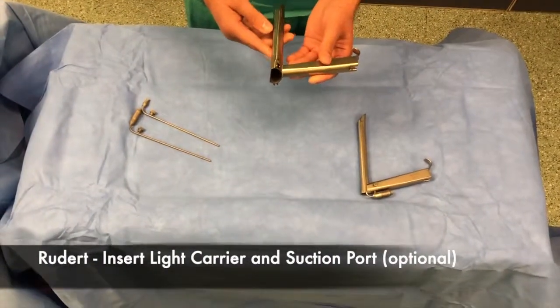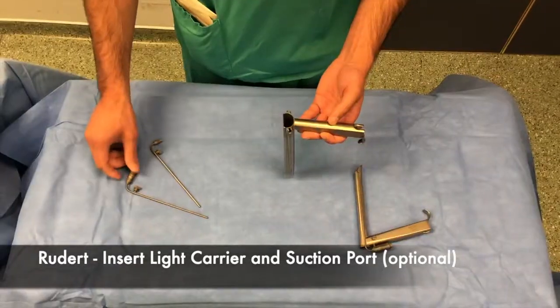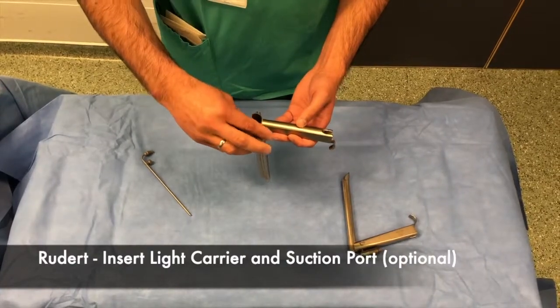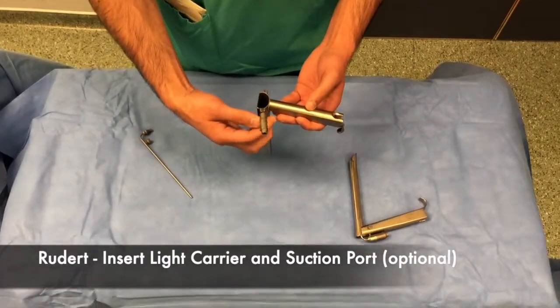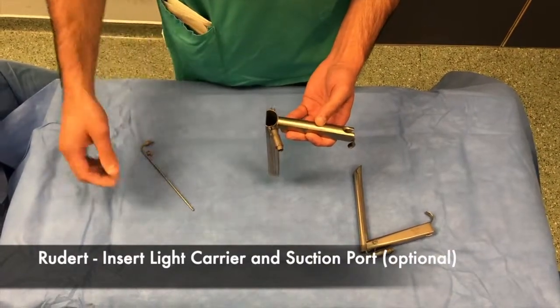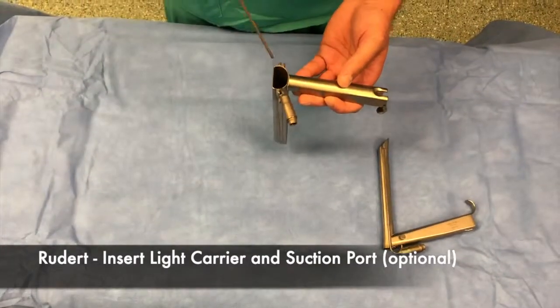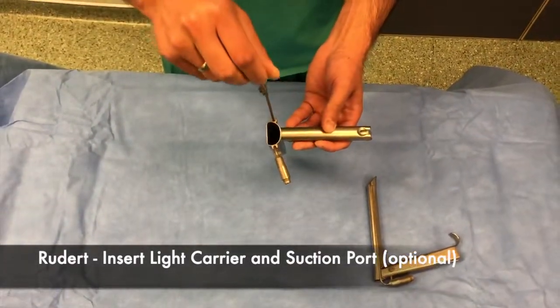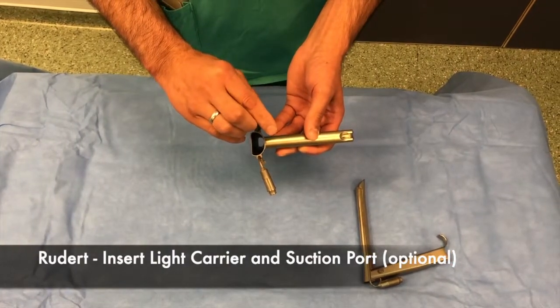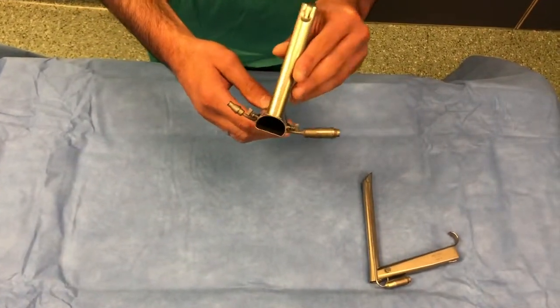The Ruddert Laryngoscope has two ports available for insertion of a light carrier as well as suction. The light carrier is inserted first, and the light lead can then be attached as required. A suction port is optional, but when performing bipolar or any laser through the laryngoscope, smoke can easily be evacuated using this suction port. Suction tubing is attached here when the scope is in situ.